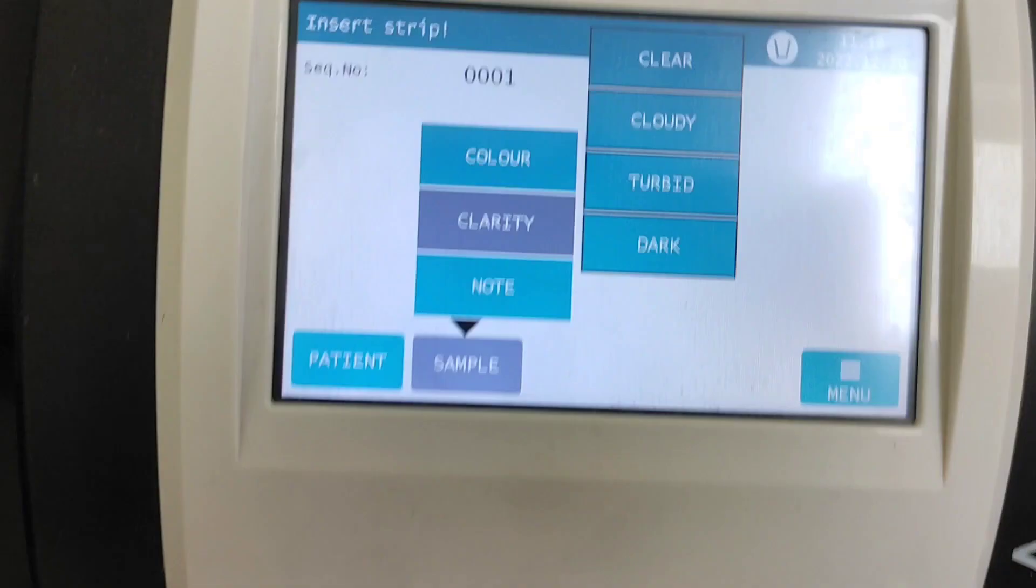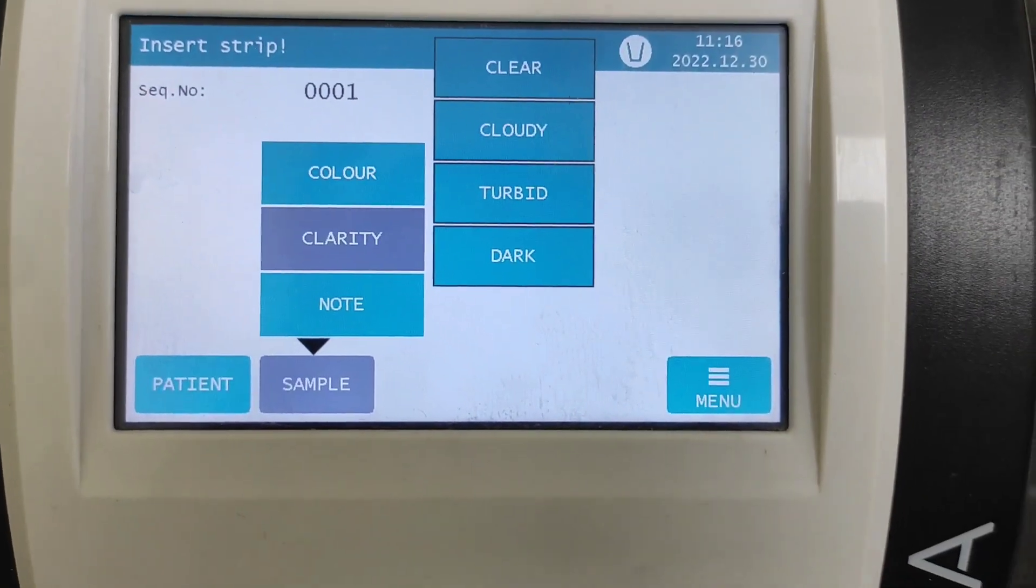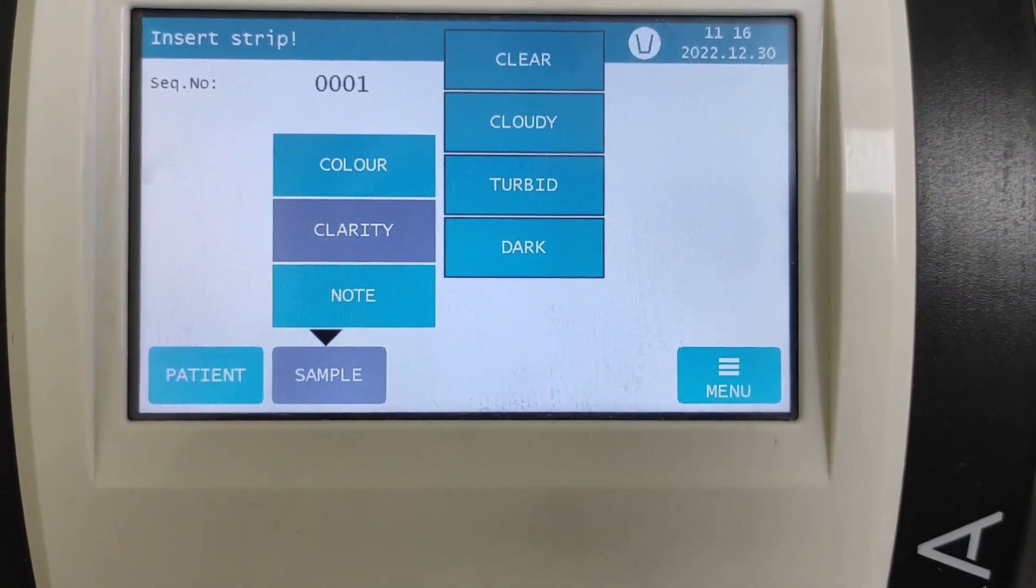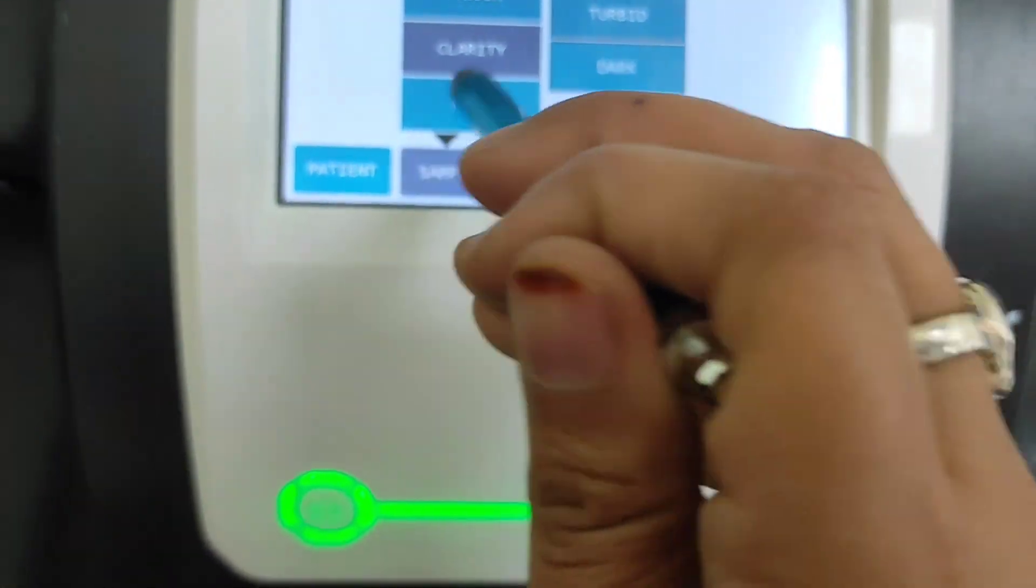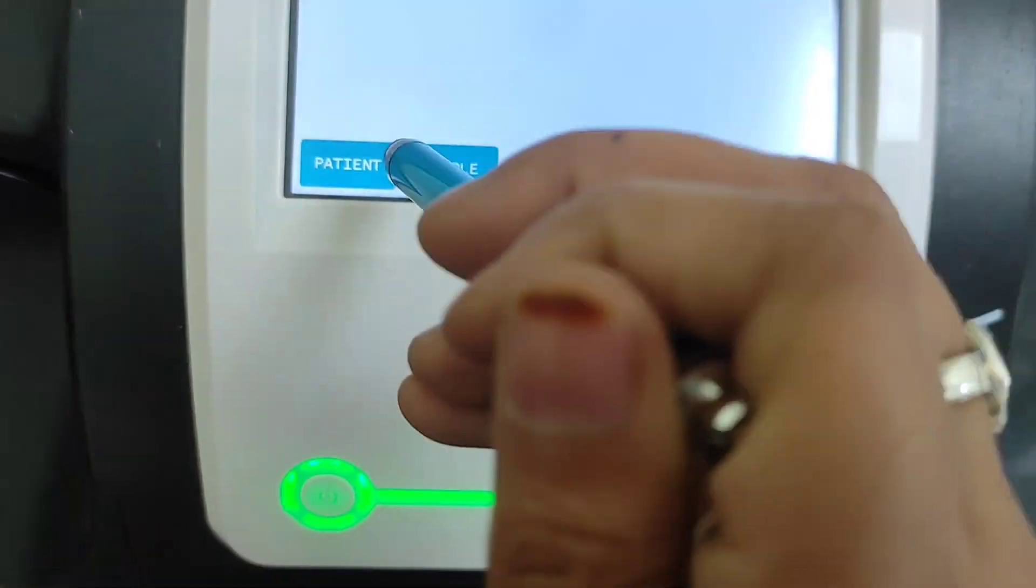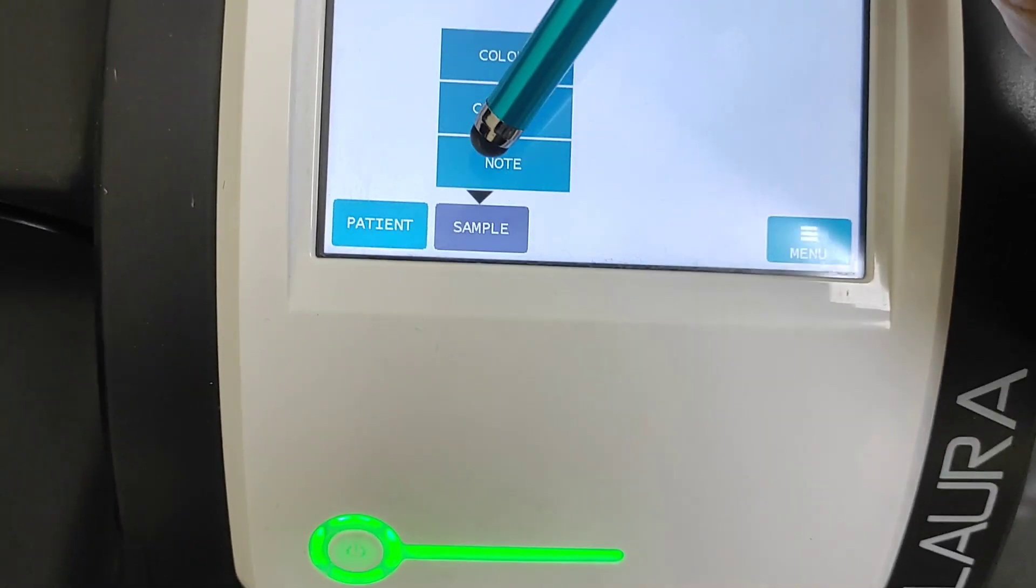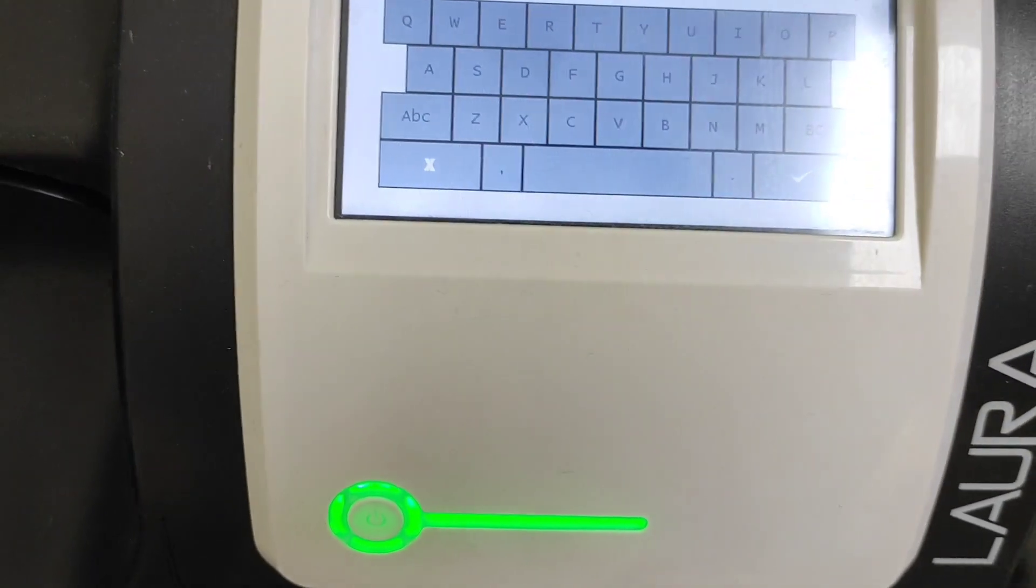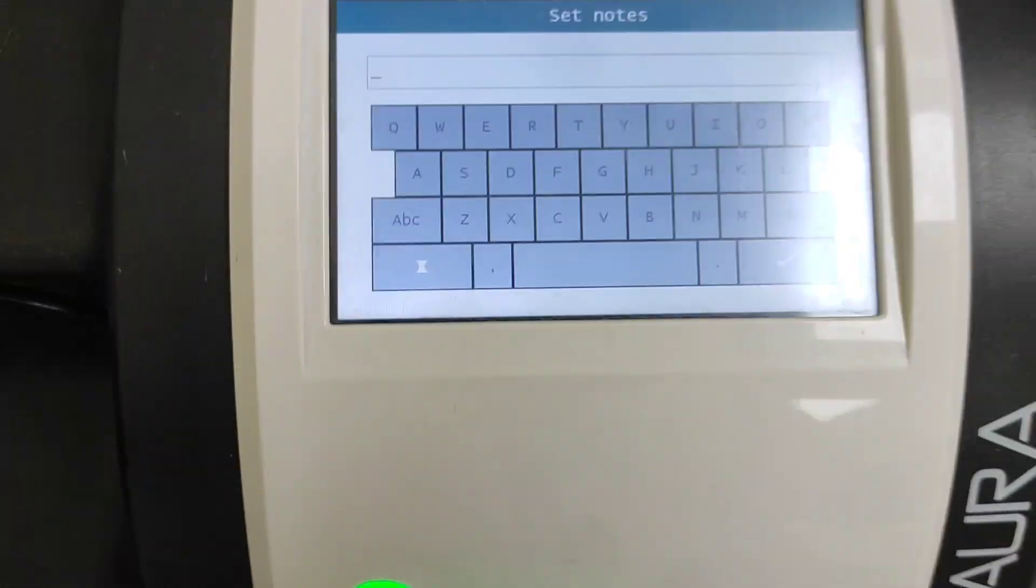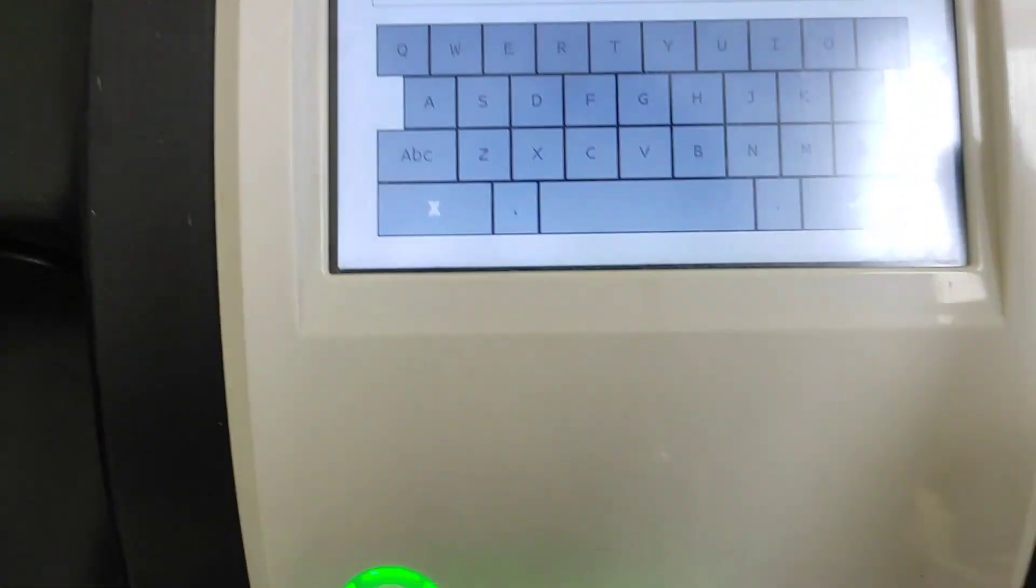Or clarity, so now let's just go on clarity: clear, cloudy, turbid, or dark. The third option is note, so whatever note you want to write you can write here.